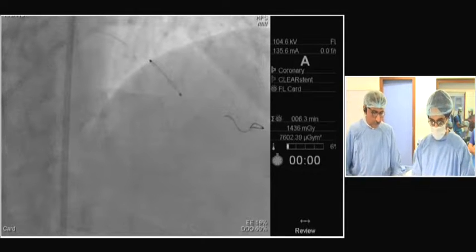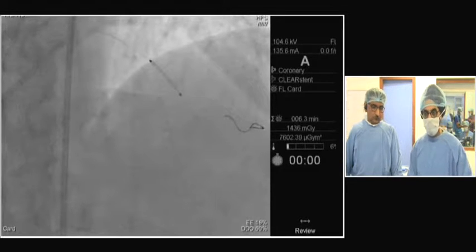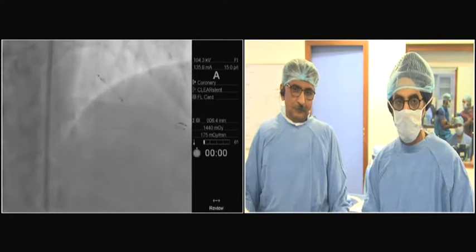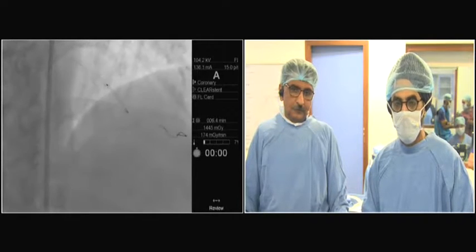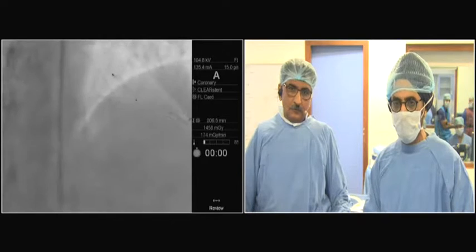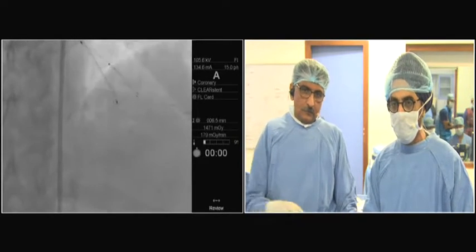Dr. Barber, it's Dr. Chu here. I guess the question in everyone's mind is, with whatever technique you're going to do, how are you going to deal with the discrepancy in the size of the proximal, mid-vessel and the distal? Right. So if you see the angiogram very carefully, just after the aneurysm, the size of the vessel is about 4 and looks quite normal on the IVUS.